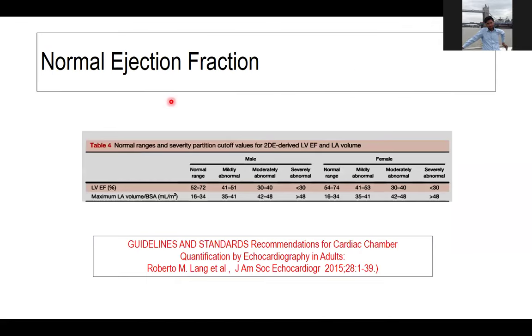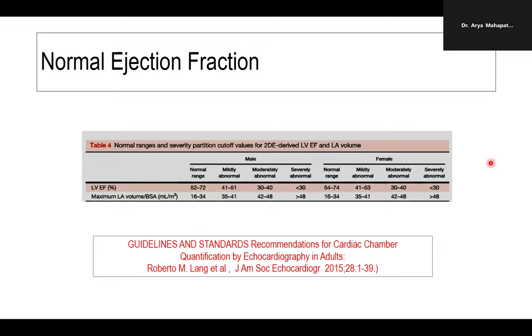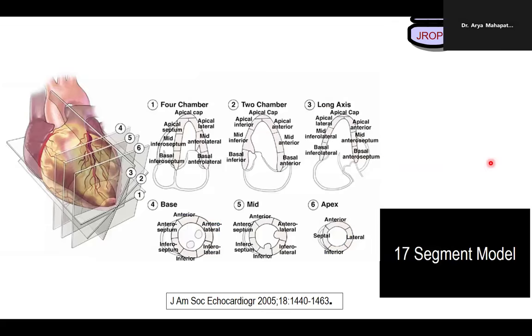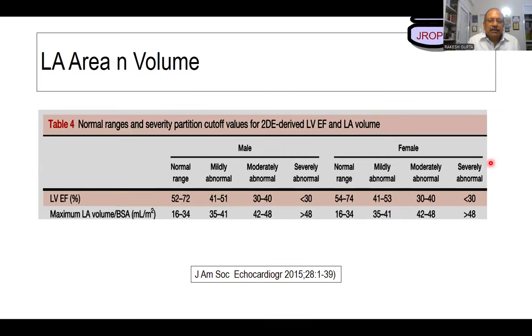All right. So anybody else? Sir, good evening. Myself, Dr. Arya, roll number 2. Dr. Arya, go ahead. Sir, I have a confusion on right ventricular free wall thickness measurement and the RVOT proximal and distal and the measurement of TAPSE and what is its implication. Kindly, please. Yeah, sure. Just give me a second. I'm coming down.